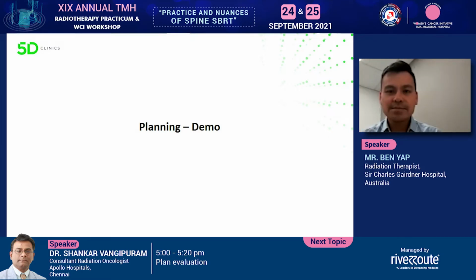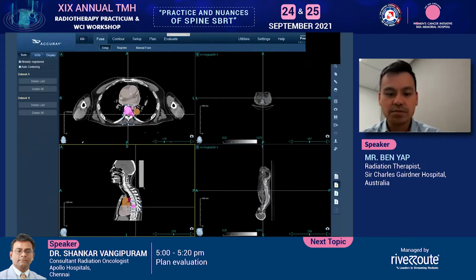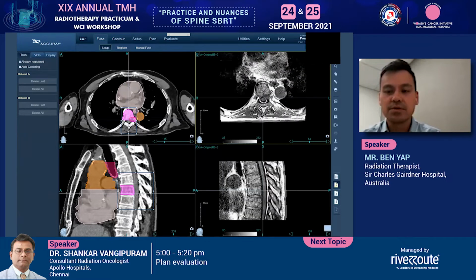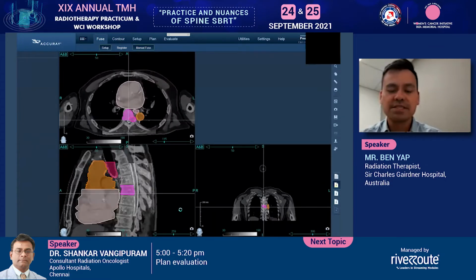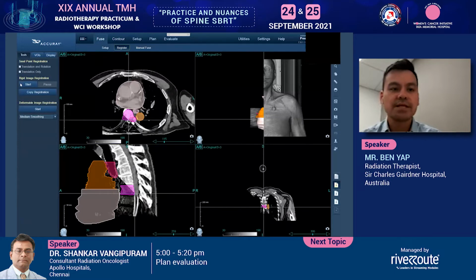All right, so just as discussed from the previous slides, what we have here is our T7 patient case, patient A. And like I said before, at the fusion bit, you want to ensure that your box only looks at the target itself, and then that will help with your MR fusions to be as accurate as possible. My recommendation is that you actually go into the manual fuse, physically move it as close as possible, then go to register, and then hit the rigid image registration.